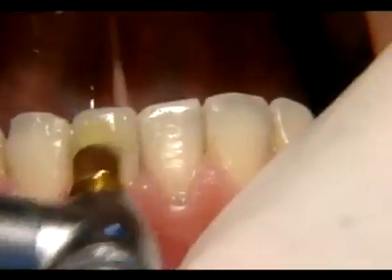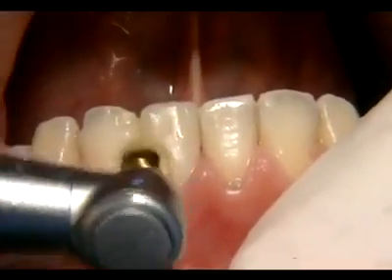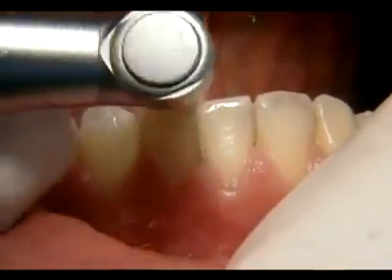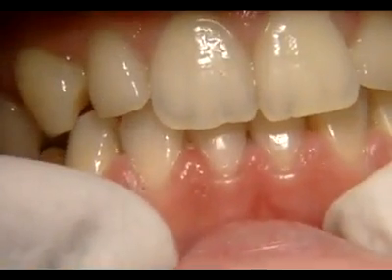To complete the procedure, the restoration is polished to a high gloss using abrasive brushes. Completed restoration.